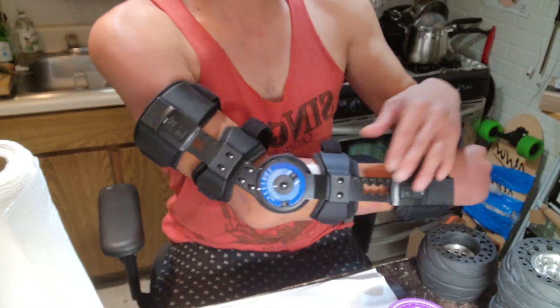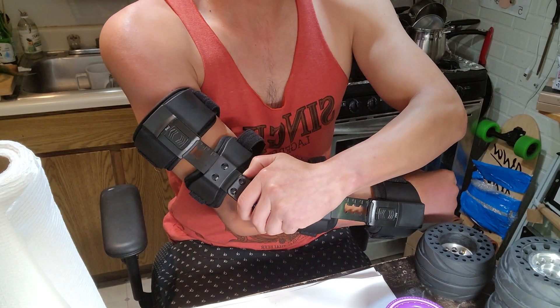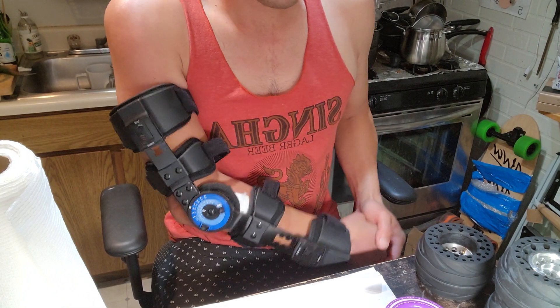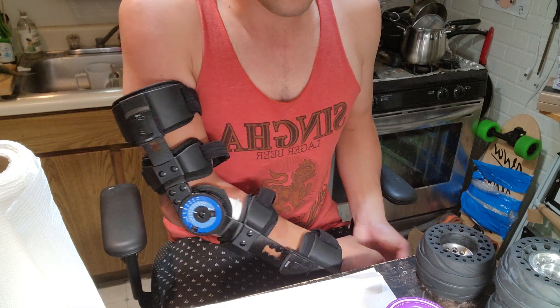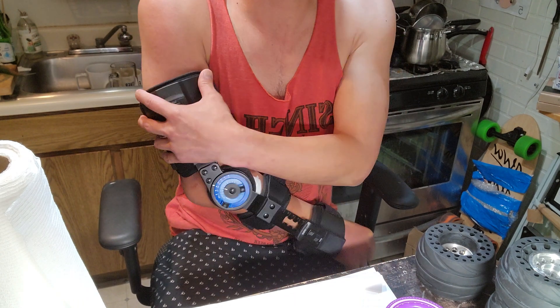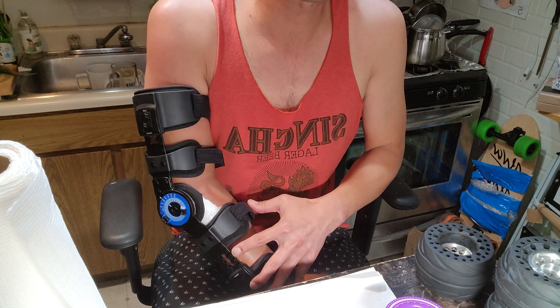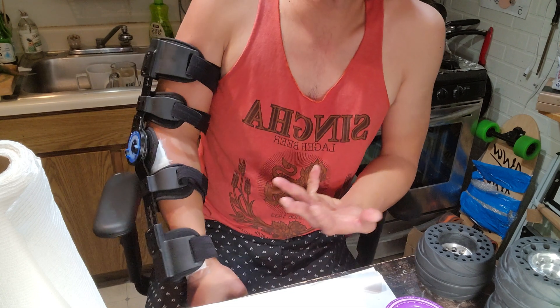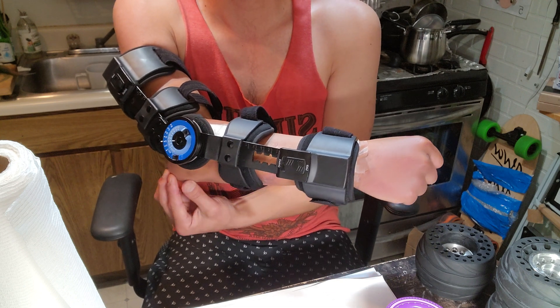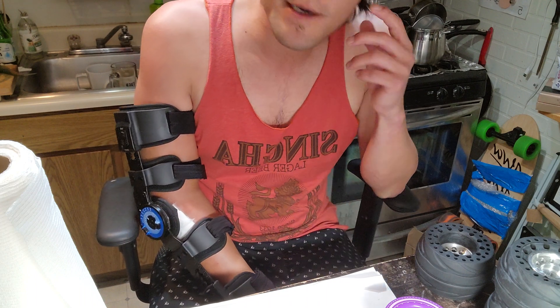Quick review of my robot arm: it's got two steel plates. The dial isn't super solid, but it will prevent injury. The other night I wasn't wearing it and my arm started having almost like a seizure — flexing by itself, probably from the bruising. So I wear this every night. It prevents me from hurting myself and helps the bones basically grow back together after a break.